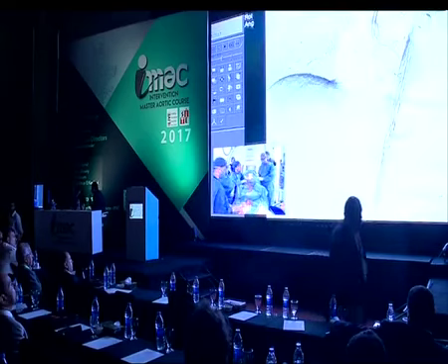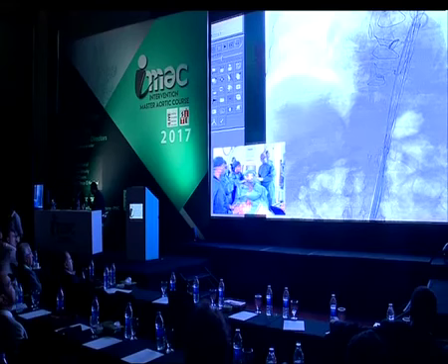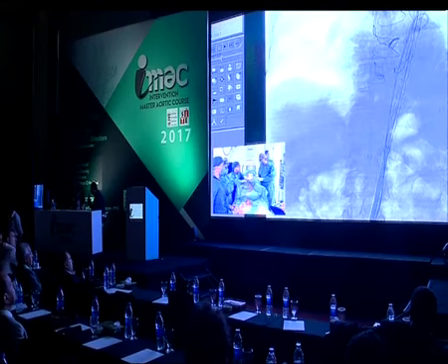Okay. Yes, very clear now. You are deploying. Okay, deployment started.